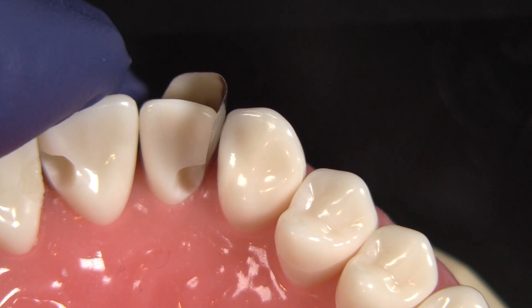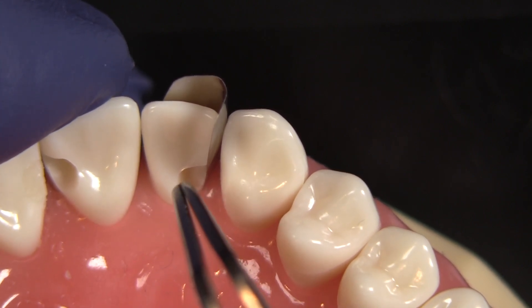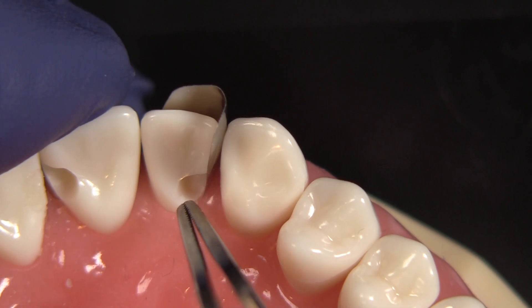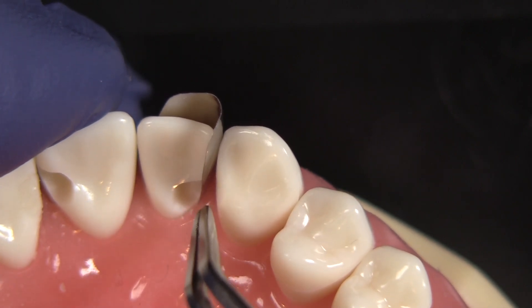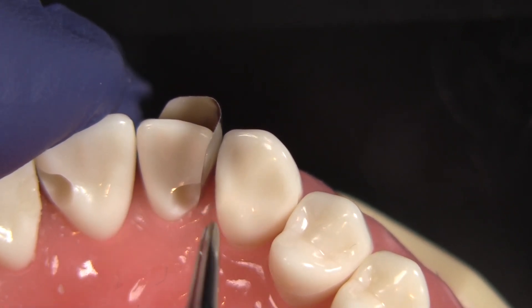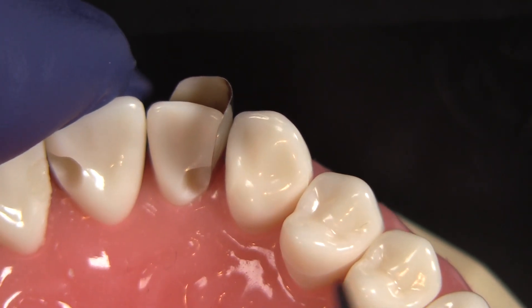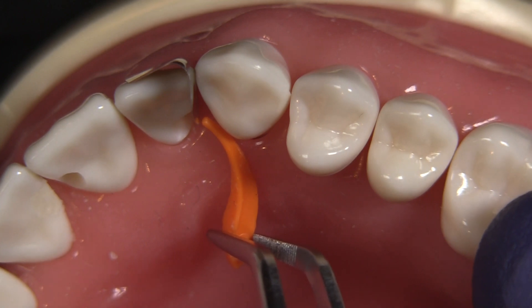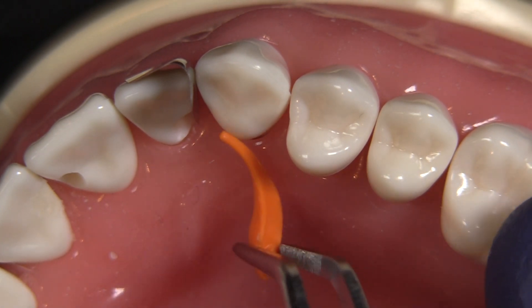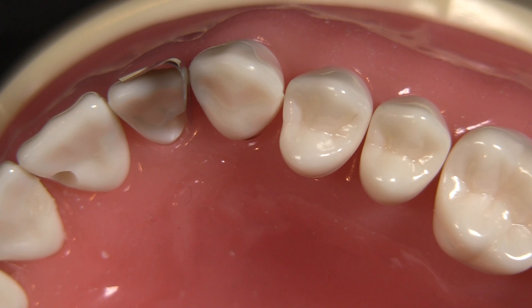This is maybe a difference between a clear strip or a varistrip, and this system — I'm worried about the interproximal anatomy. I don't want my matrix band to extend all the way over to the middle of the tooth, because I can shape that, I can see that, I can have control over that. But where my seal is interproximally — that interproximal anatomy that I can't get to with a burr — that's what I want to be sealed. And these curved wedges will help as well. In an ideal situation, I'm going to want to place that wedge where it curves around the tooth and has that larger part of the wedge putting pressure on this part of the prep right here, so the cervical margin of the prep is held against the tooth.